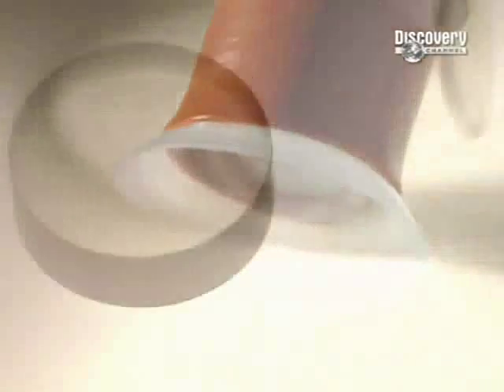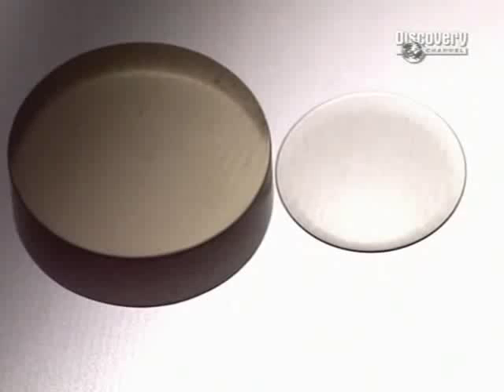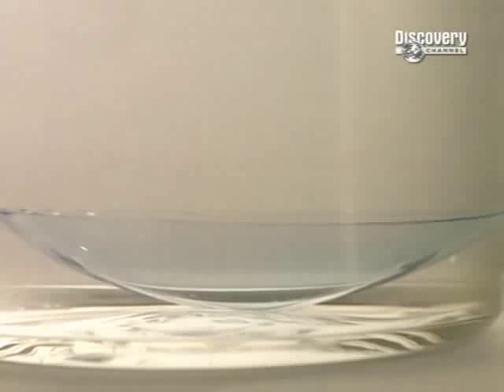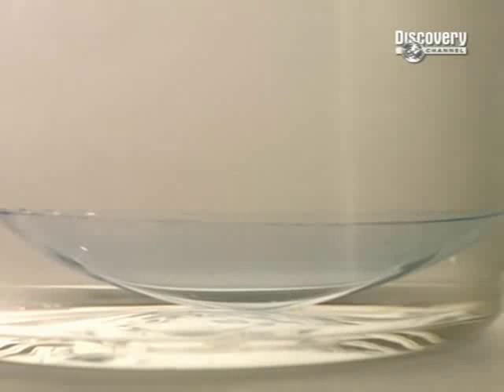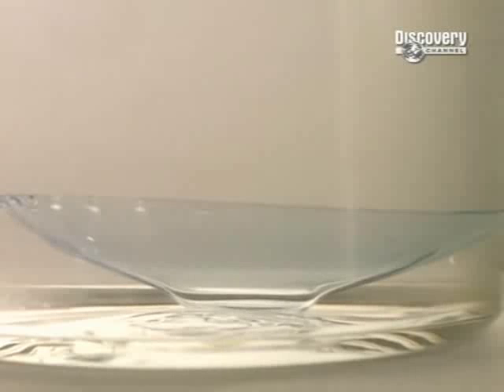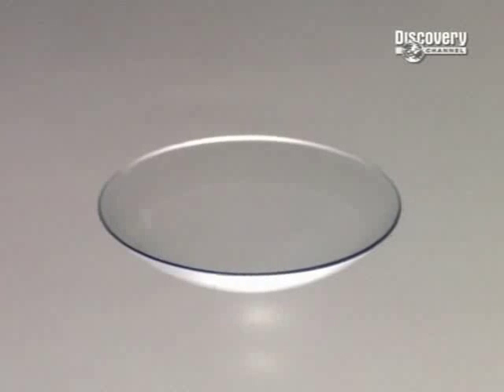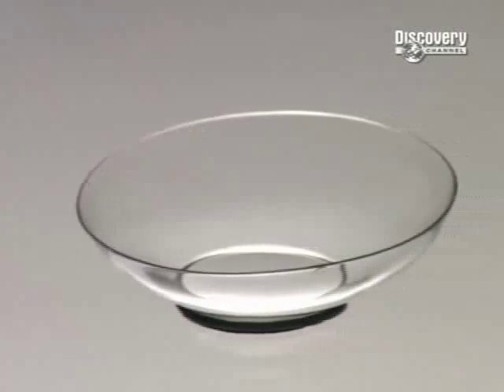A technician then polishes the rims of the lenses. The polymer is then hydrated to make it flexible. Lenses remain immersed in a balanced pH saline solution for 24 hours. The lens becomes engorged with liquid and expands, reaching the desired proportions.